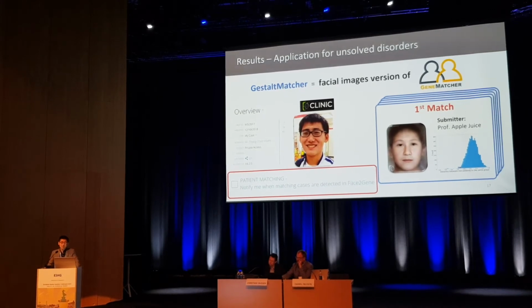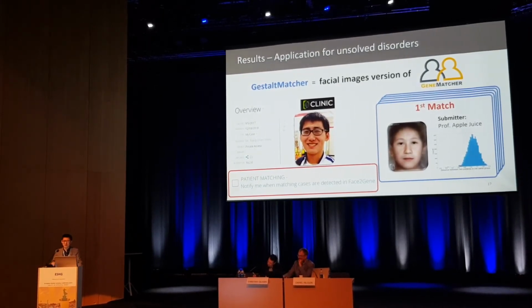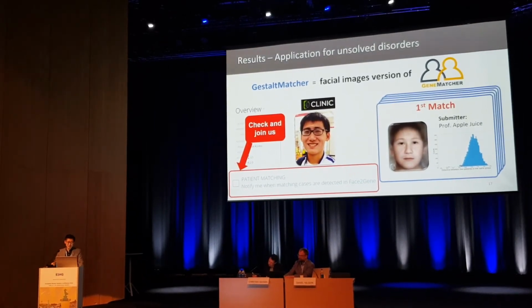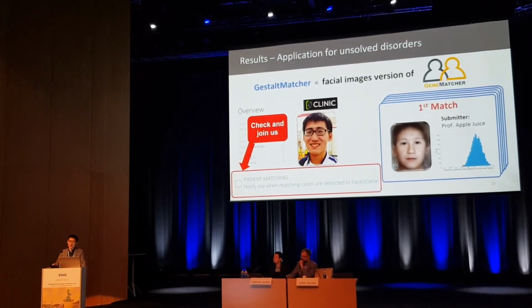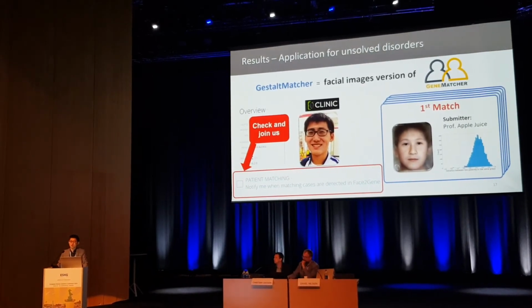And if you like our study and would like to join us, please go to your patients page in the Face2Gene platform and simply check the patients matching box here. Then once we have the matched patients, the clinicians will be put in contact with each other. And of course, only the unidentified data will be shared. No one is allowed to access the photos, including us.